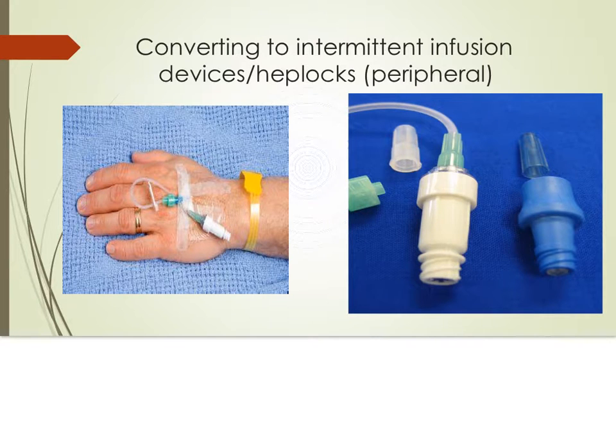In some facilities, when the IV is initiated, a saline lock is not immediately used. Therefore, the tubing may be connected directly to the hub of the IV cannula. In such cases, the tubing cannot be removed without immediately attaching a saline lock or intermittent infusion device.